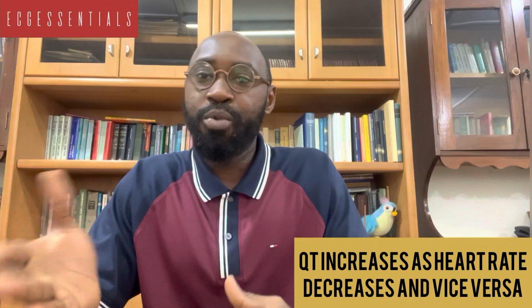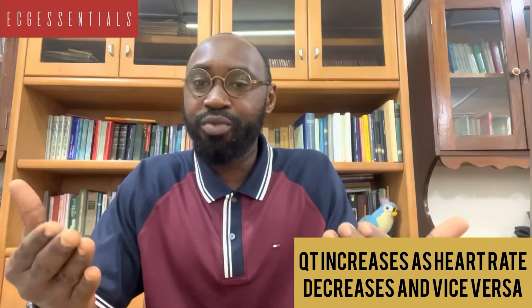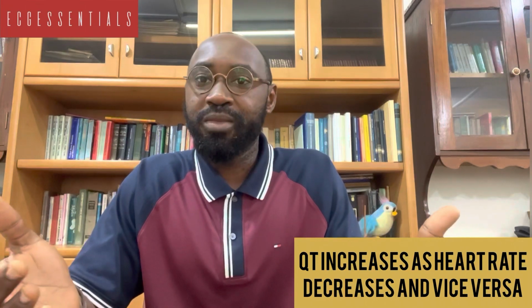And we have said earlier as well that this QT interval is inversely proportional to the heart rate, so that as the heart rate increases, we expect that the QT interval will be shortened, and the opposite is true. So if the heart rate should decrease, we expect that the QT interval will increase.